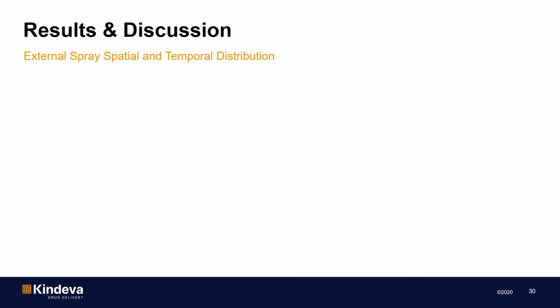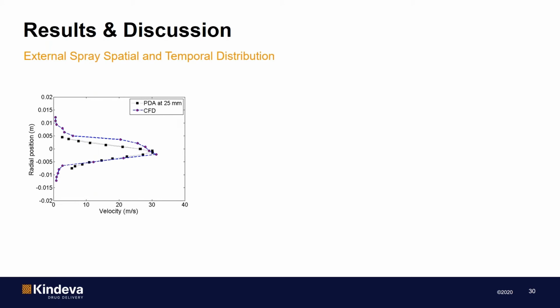Now, moving forward, to gain confidence in our spray model, we compare the CFD prediction against our phase Doppler anemometry measurement of the spray. I should mention that the measurements are conducted on a spray injected into still air, whereas the CFD model, as you saw, has the spray injected into a confined space with finite co-flow. However, we believe that the comparison should give us a good understanding of the order of magnitude and validity of the model. So the first figure here shows the spray velocity magnitude at various radial positions at 25 millimeter away from the spray orifice.